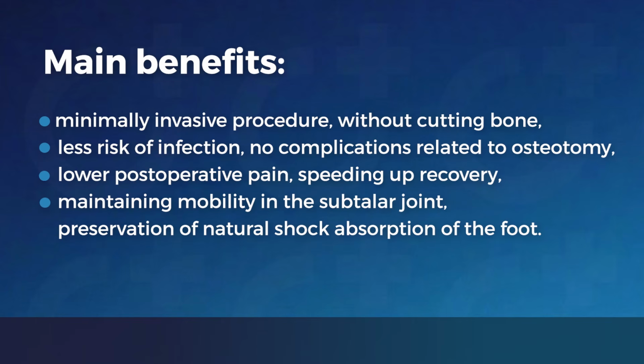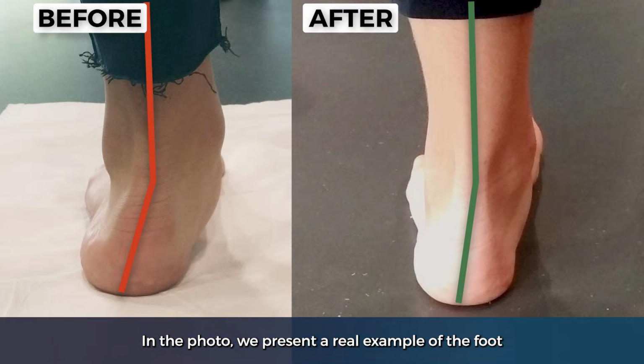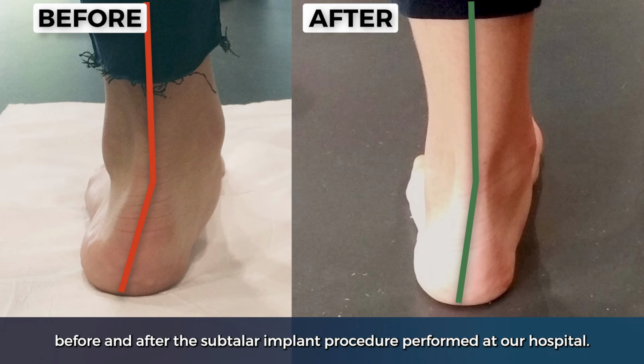What are the main benefits? This is a minimally invasive procedure without cutting bone. There is less risk of infection and no complications related to osteotomy. The benefit is lower post-operative pain. It speeds up recovery. We can also maintain mobility in the subtalar joint and preserve natural shock absorption of the foot. In the photo, we present a real example of the foot before and after the subtalar implant procedure performed at our hospital.